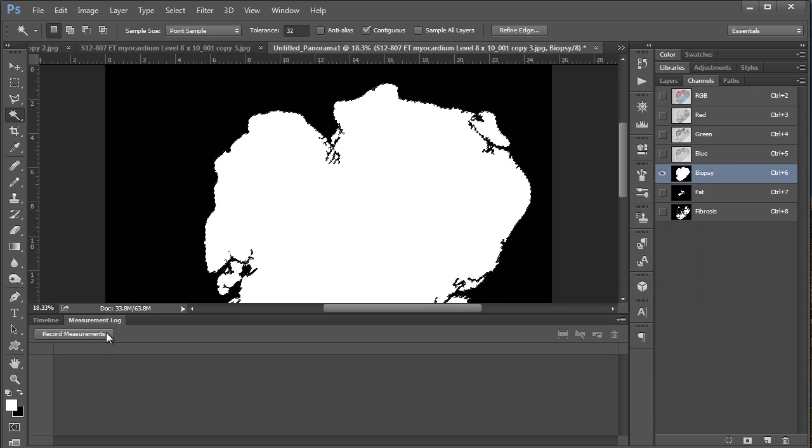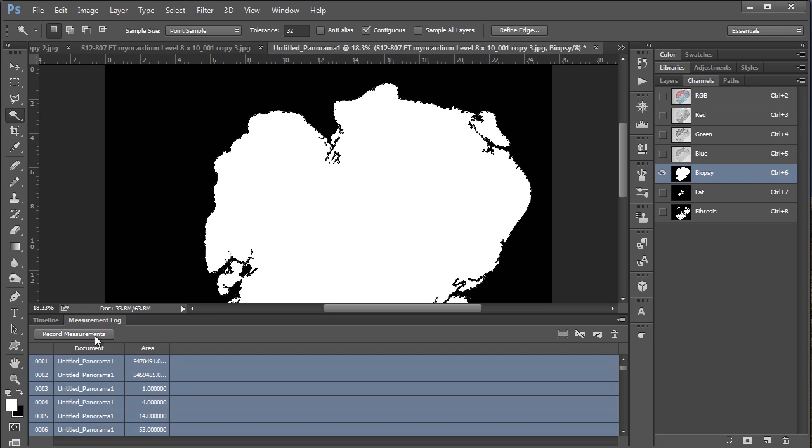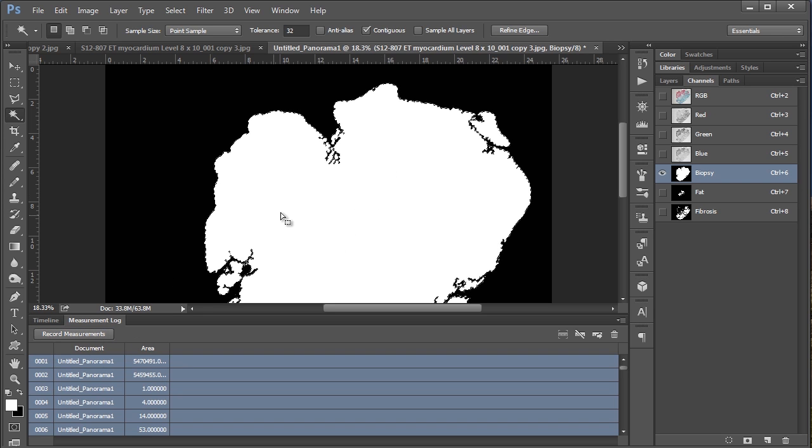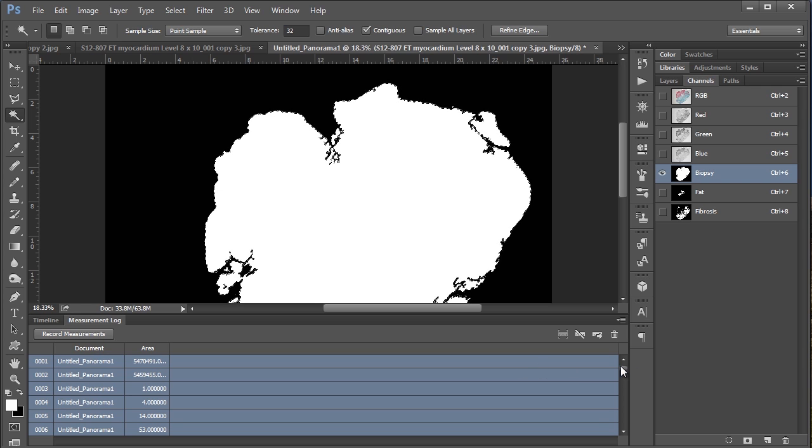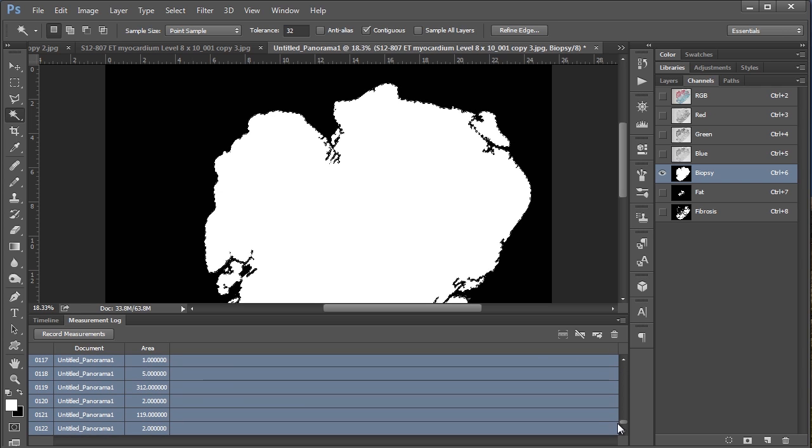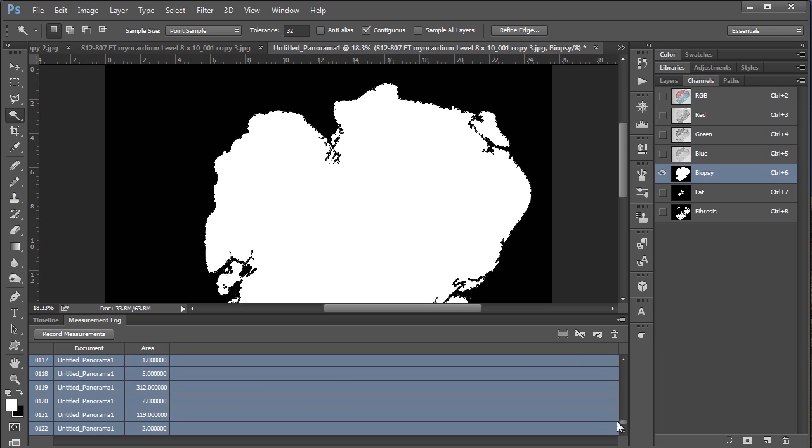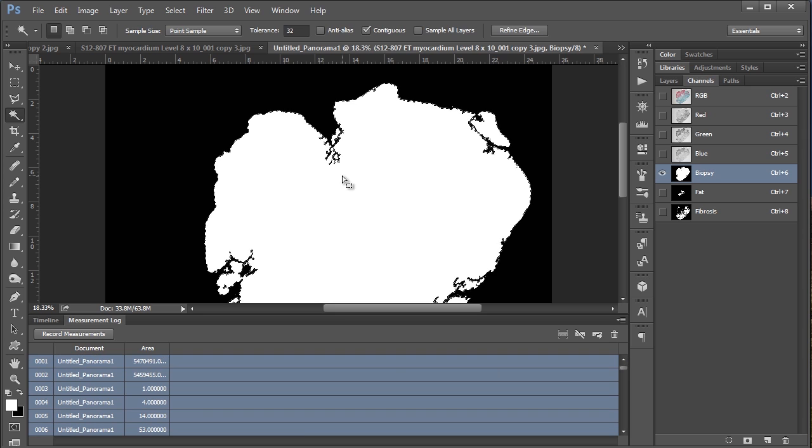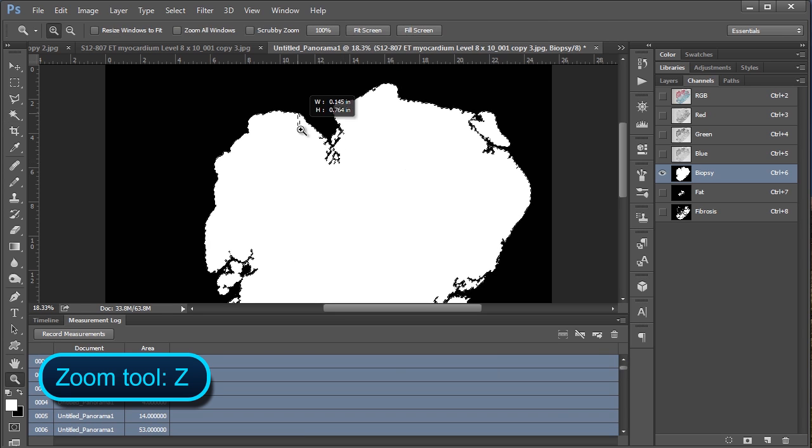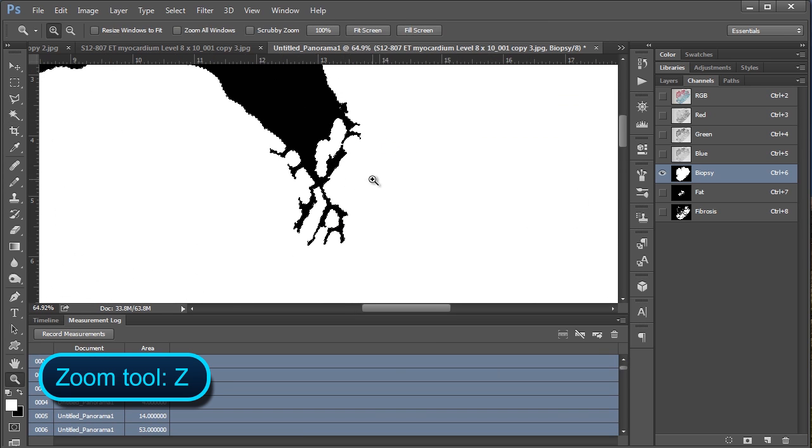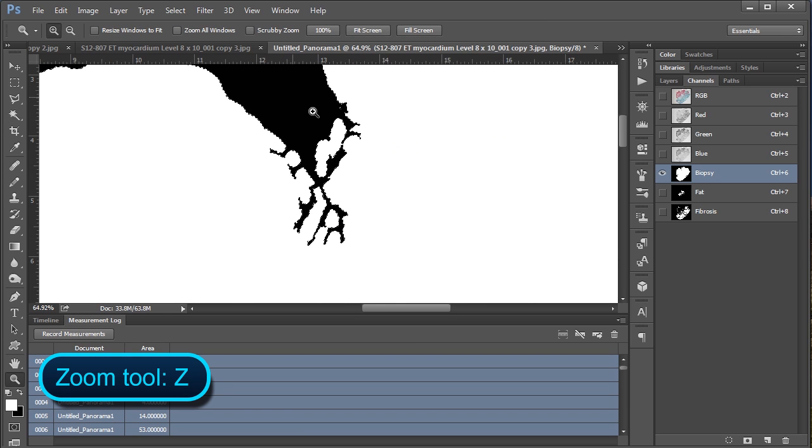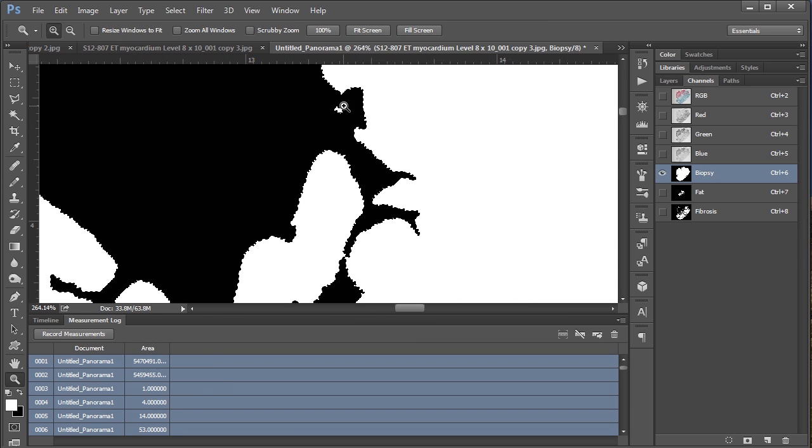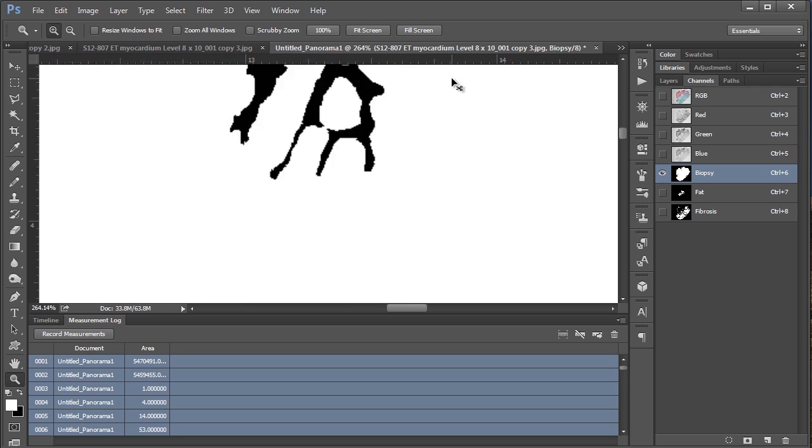And so now all you need to do is hit record measurements. And so Photoshop is going to count all of the white pixels in this case. Now I've got a list of about, if we scroll down, 122 different area measurements here. And those all come from, if we zoom in, little specs like this that you wouldn't normally see.